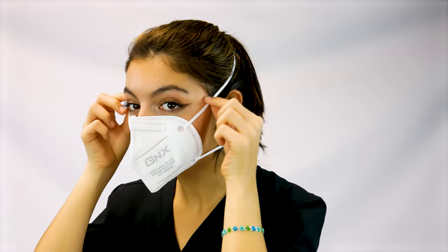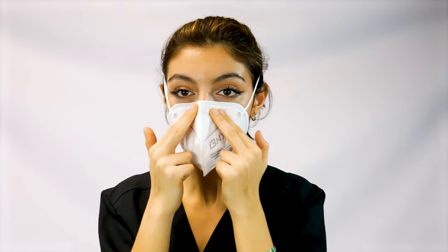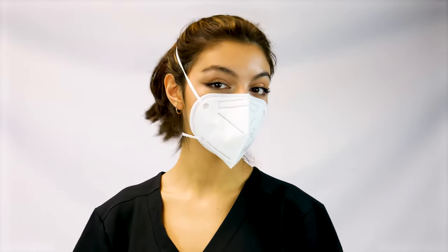Straighten the bands and adjust the mask to a comfortable fit. Conform the nose piece to your nose. Press with your forefingers against the sides of your nose and cheeks to ensure a tight fitting seal around your nose.